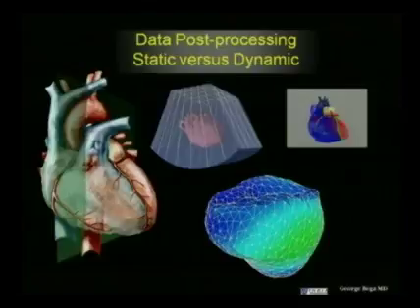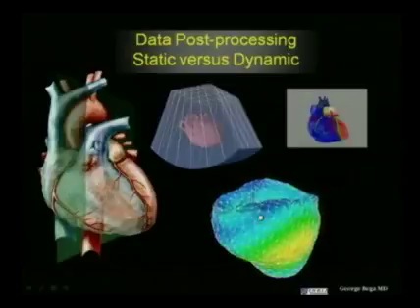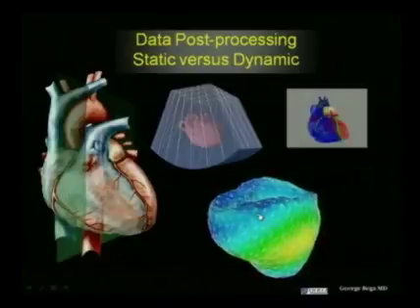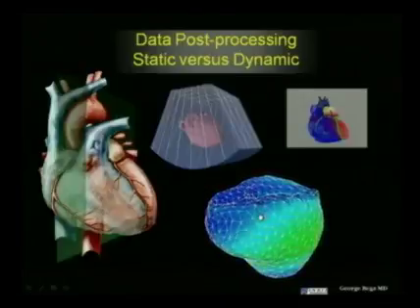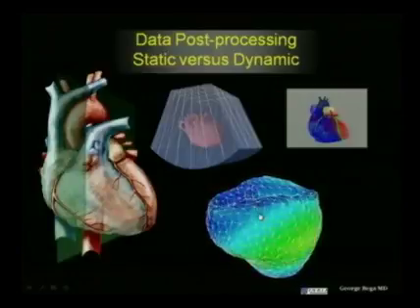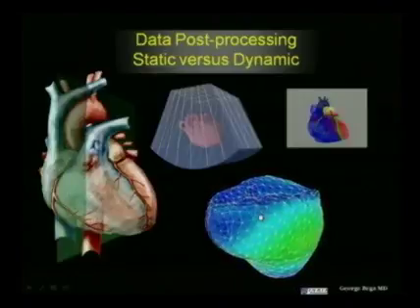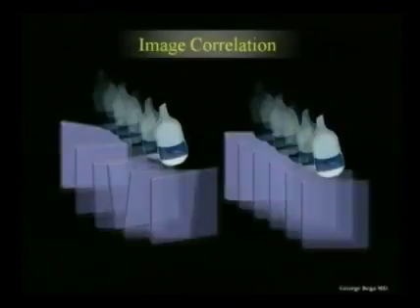Nevertheless, the orientation of the heart views could be analyzed this way. Now, with STIC technologies, or spatial temporal image correlation, a volume can be acquired and peak systole and diastole can be displayed at the same time. This is really the real advantage. Of course, the STIC technology right now works with mechanical transducers, and it is a temporary solution until the matrix arrays become an everyday reality.